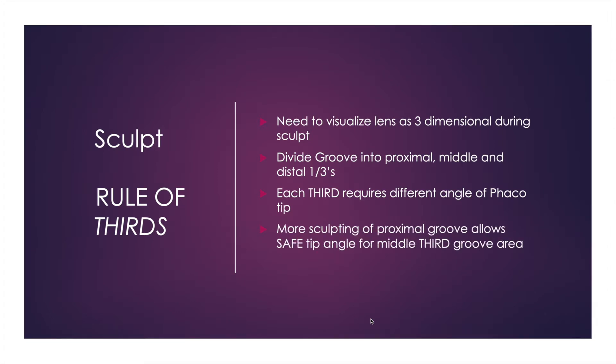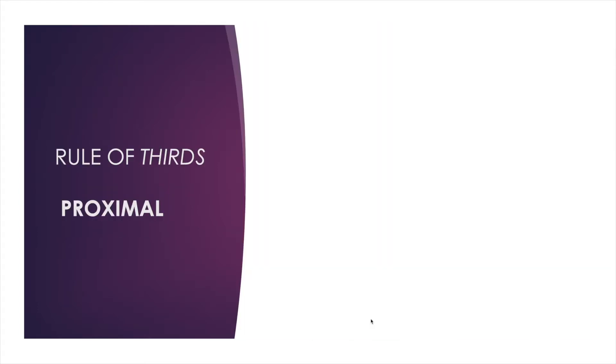More sculpting of the proximal groove will allow for the safest tip angle, as shown in our thought experiment. So now let's apply the rule of thirds, focusing on the proximal section of the groove into the lens during cataract surgery.